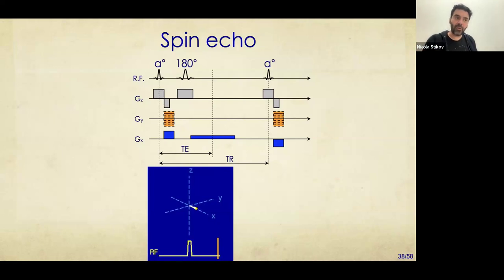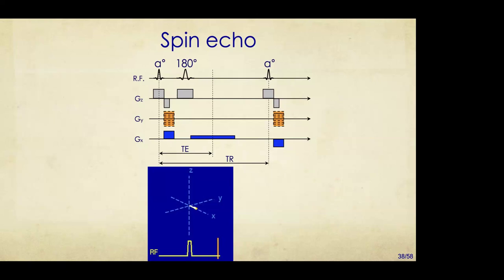You could be working with other atoms. You could be working with phosphorus, for example, because again, it's phosphorus 31, so it has a magnetic spin. So different kinds of compounds will have different kinds of properties, and you can have MRI scanners that can tune to the different frequencies, but most of the time we're working with hydrogen, and hydrogen in water is the one that gives us the strongest signal. Okay.